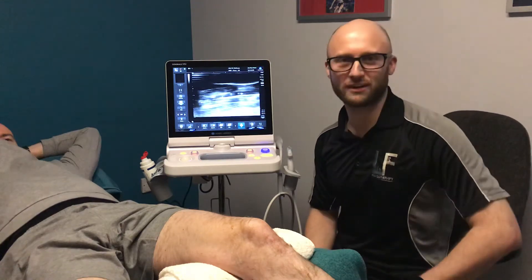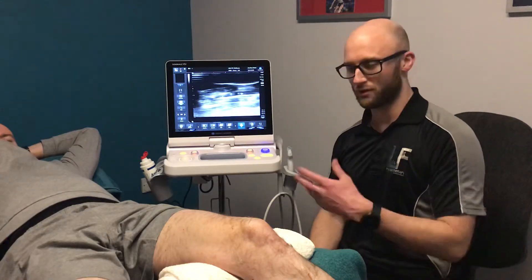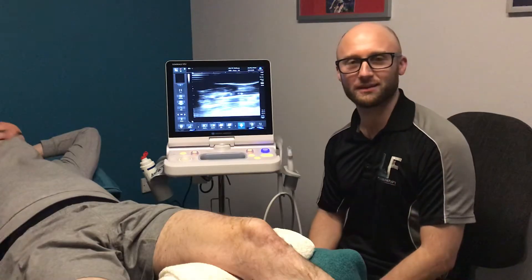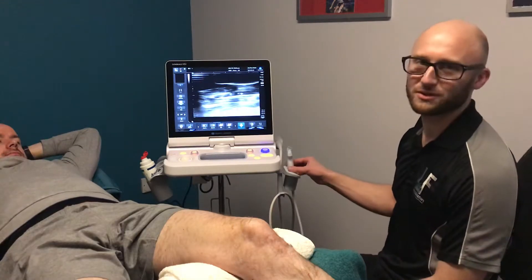Hi everybody, I thought I'd do a short video on our diagnostic ultrasound machine here and just demonstrate quickly how it can be used around the knee. I've grabbed Emmett here from the clinic and you may know him as one of our physical team. He assures me he's got a perfectly healthy knee but we'll see how it looks on ultrasound.